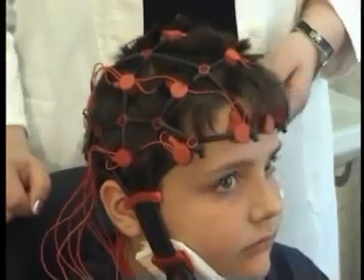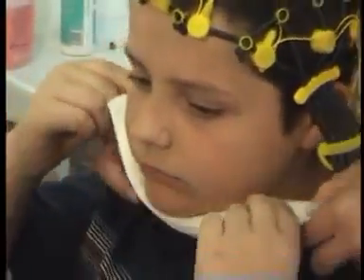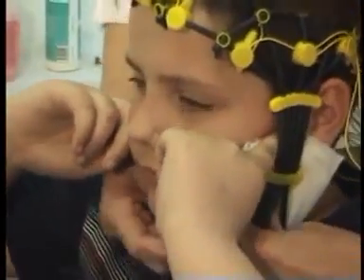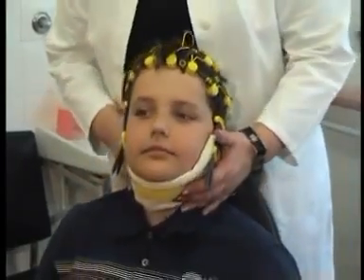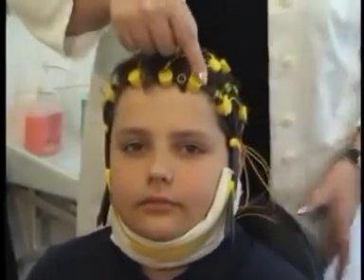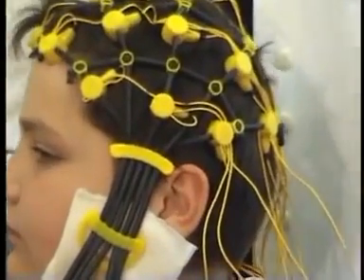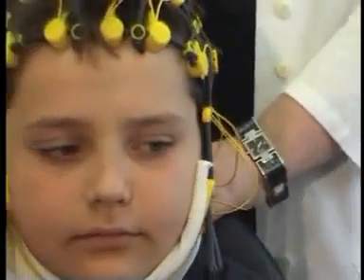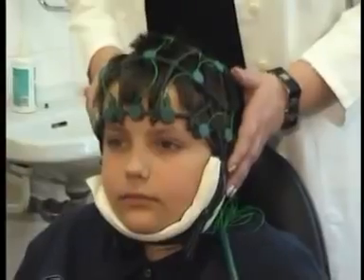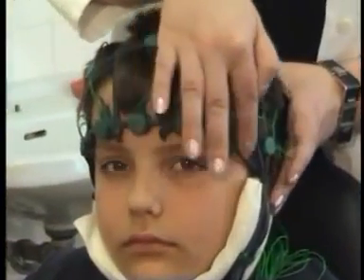This is an example of a poorly chosen size of our COMBY EEG cap. This boy is 10. However, due to circumference of his head, a red cap meant for adults is required. If we use a smaller cap than needed, we can see that the electrodes are placed on inadequate locations. You can see that FP1 and FP2 are placed too high and do not detect the required areas. The same thing happens with other electrodes. If we choose a larger cap, the electrodes are placed too low.